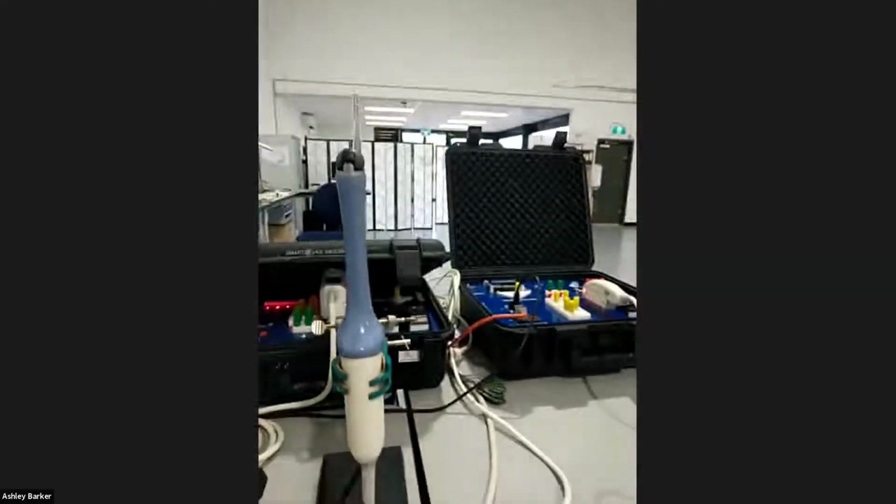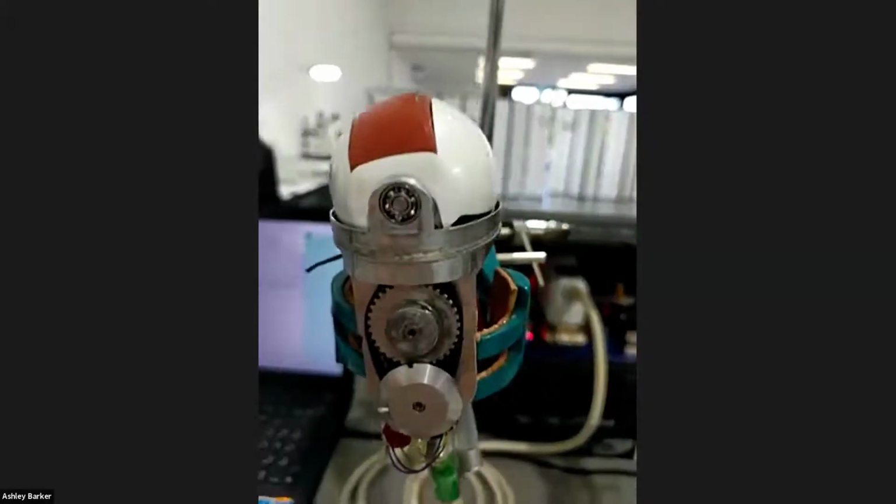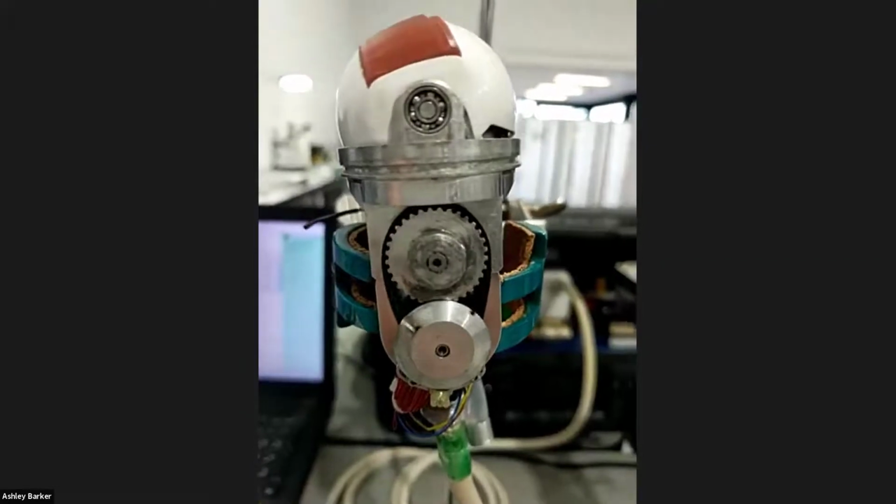I think I'm going to be heart in the mouth any minute now, but anyway. Yeah, that's right. I wish this thing would hurry up. I don't know if you can actually see that it is moving. It's not quite as nice as it was before.